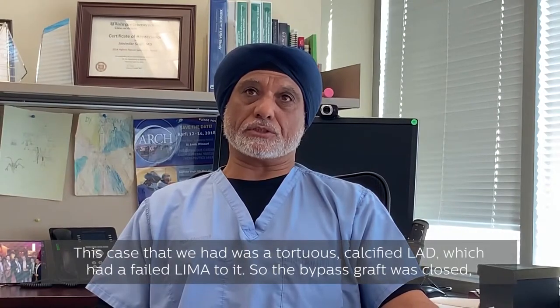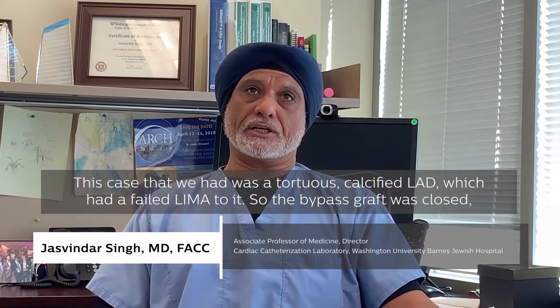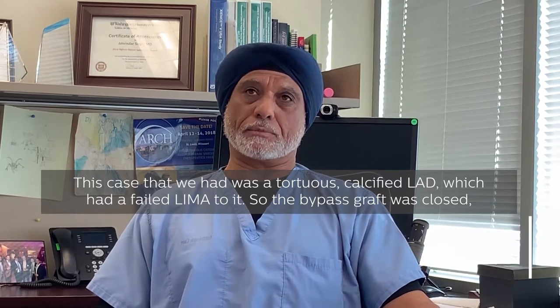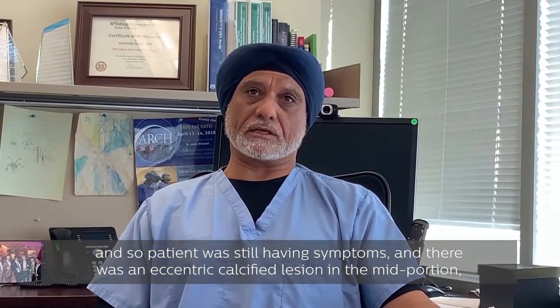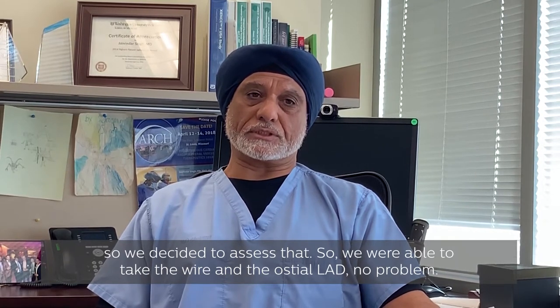This case was a tortuous calcified LAD which had a failed LIMA bypass graft. The bypass graft was closed and the patient was still having symptoms. There was an eccentric calcified lesion in the mid portion, so we decided to assess that.